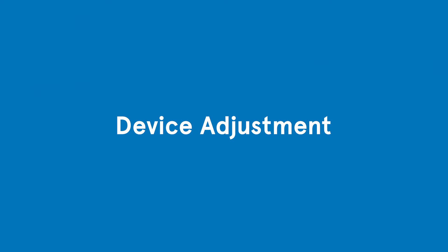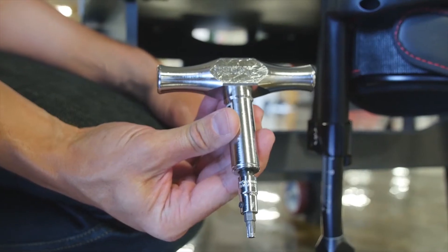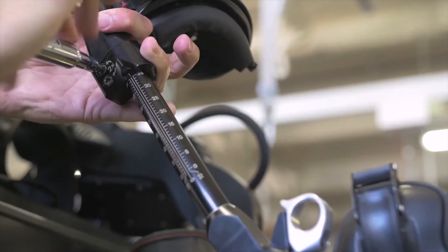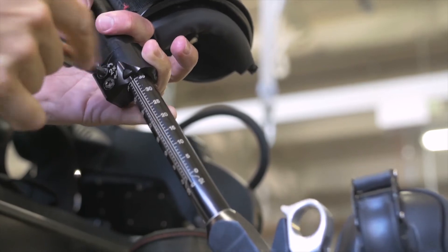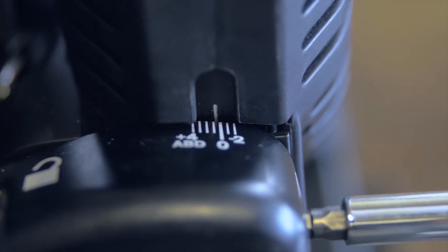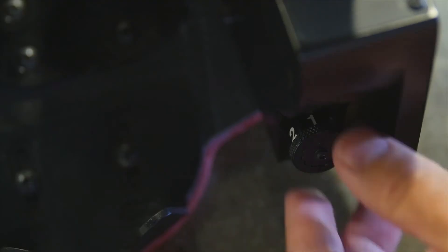Device adjustment requires two wrenches and is about a five-minute process to adjust for each patient. It was designed to be used by many patients throughout the clinical day. The adjustments include hip width, hip abduction and adduction, upper leg, lower leg, and the ankle can be adjusted as well, but no wrench is needed.